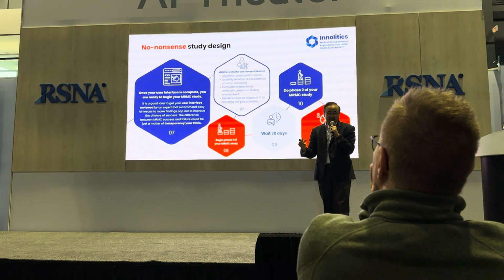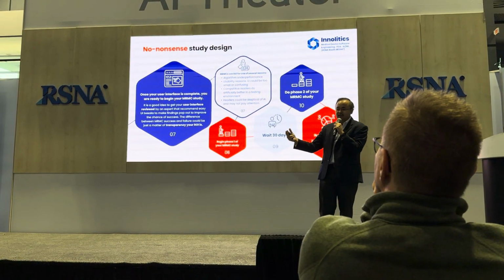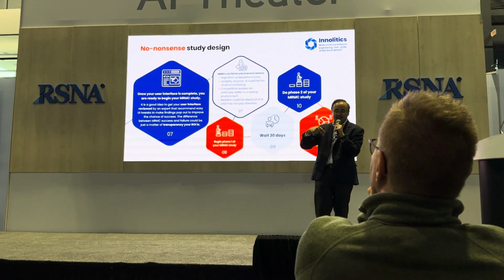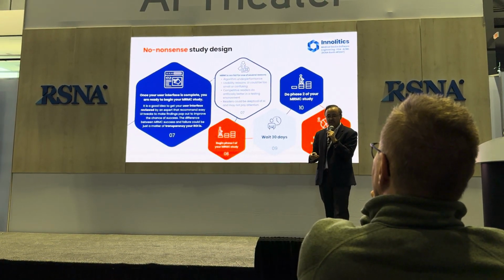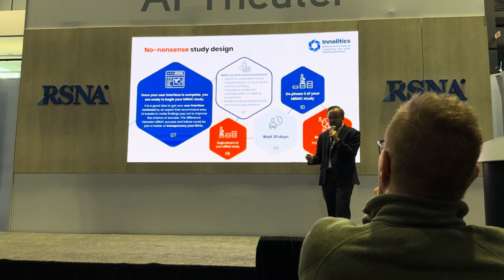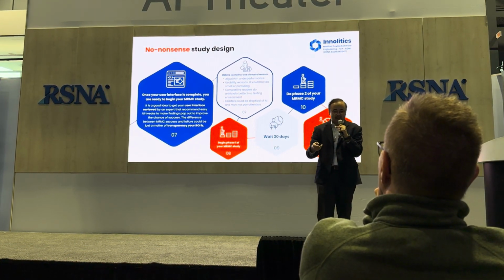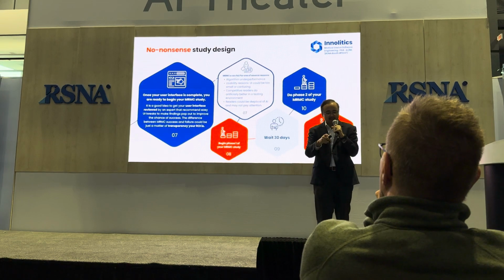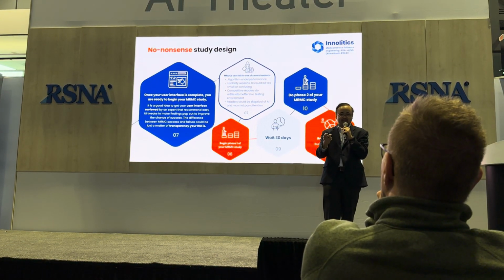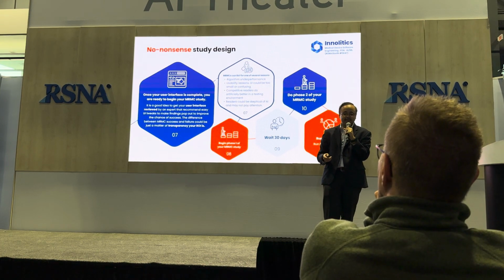Also, some readers could just be skeptical of AI and may not really want more confirmation bias or additional information. In that case too, your standalone performance test would be high and the multi-reader study would be low. And there's typically a 30-day washout, so you can see why this one is much more expensive than the standalone performance test on the previous slide that we did.